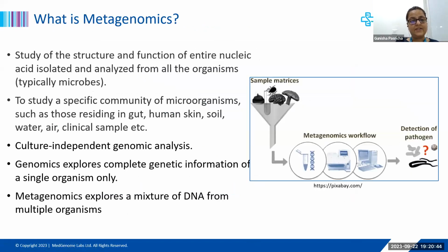Now, from next generation sequencing, I would want to take you further ahead and tell you what metagenomics is, because the metagenomics approach is the one which is explored in literature, and we at MedGenome are also exploring a metagenomic approach. So metagenomics is powered by next generation sequencing. We need to use those high throughput sequencers to actually sequence.